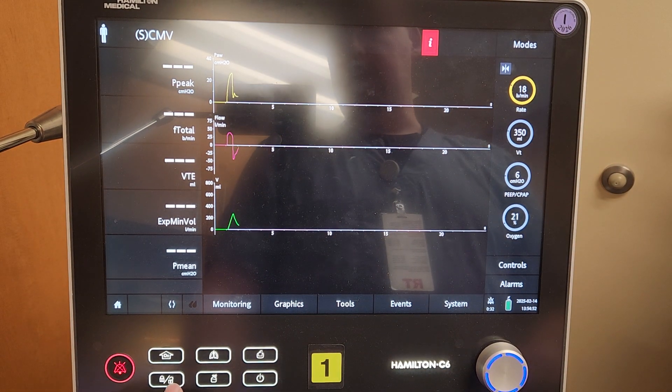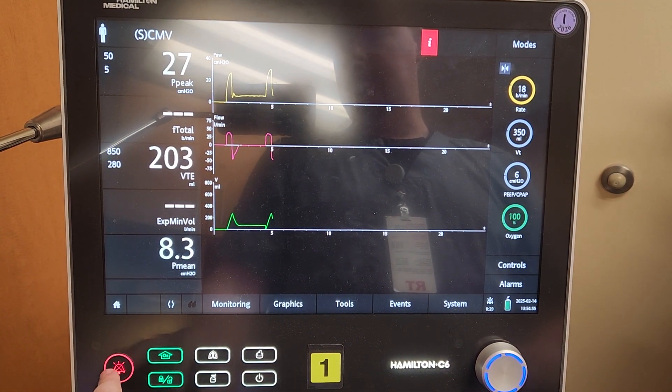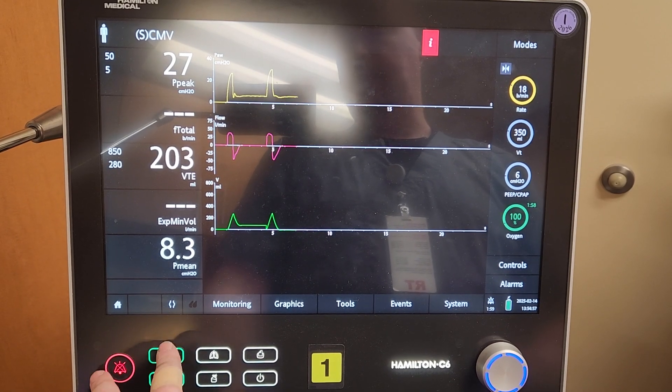The nice thing is if we do a screen lock, these two buttons — the alarm silence and the increase oxygen — are still currently active.